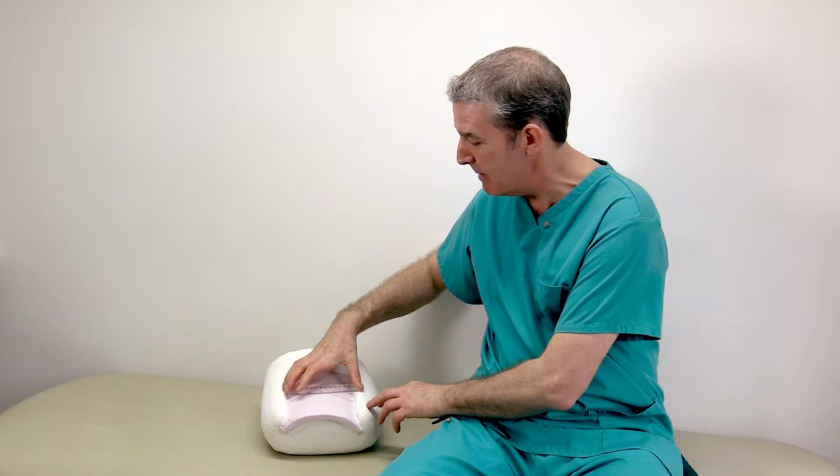Once that's taken care of, the nail can be prepared to accept a thin acrylic brace that in its quiescent state just wants to be flat like this plastic ruler. Once glued to the top of the nail, it starts working its magic straight away.